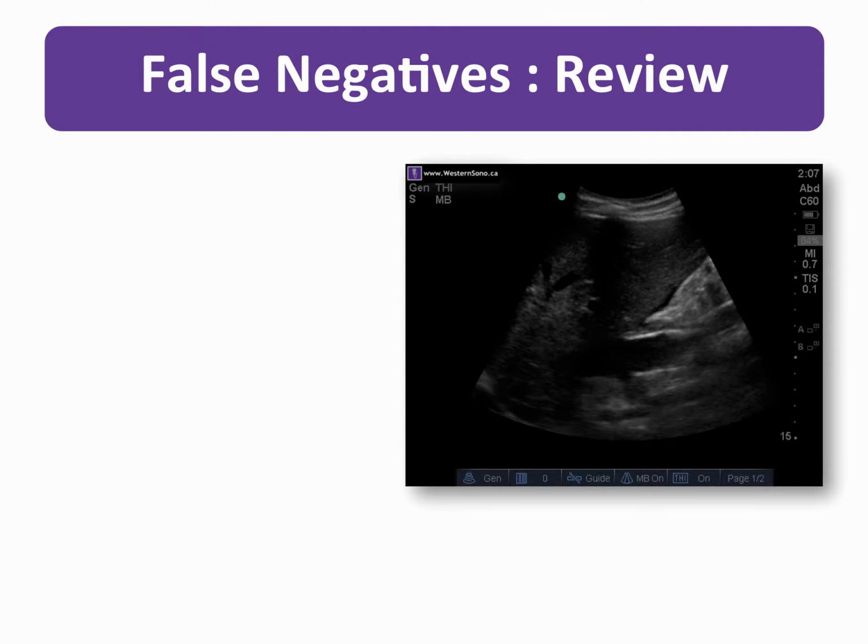First, that there is not enough blood to be detected with point-of-care ultrasound. There may be less than roughly 200 cc's, and therefore free fluid may be missed in your study. Adding the pelvic views will improve your chances of avoiding this error.